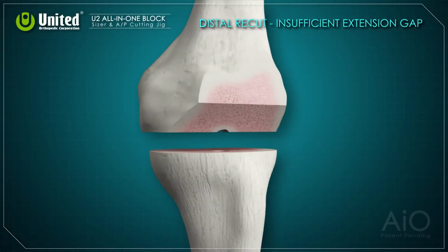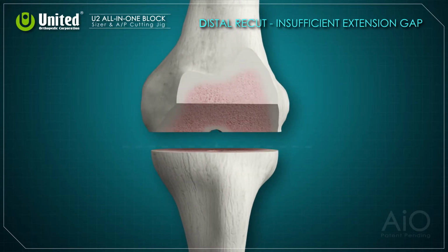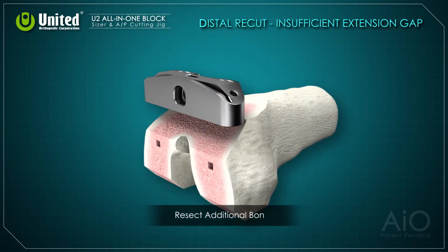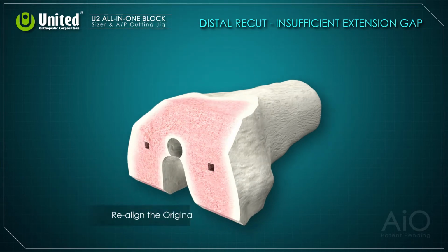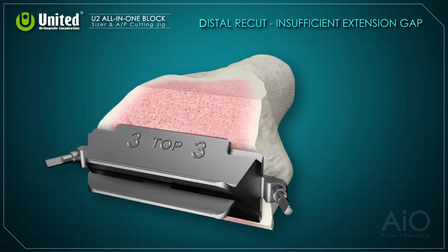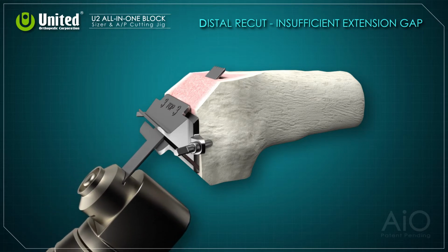During trial reduction, if distal recutting is required, realign the distal femoral cutting guide through the +2 or +4 pinholes and perform the distal femoral resection. Once the distal recut is made, reshaping the chamfer cut is essential. Realign the same size chamfer cutting jig to the same reference holes and make the chamfer cuts.